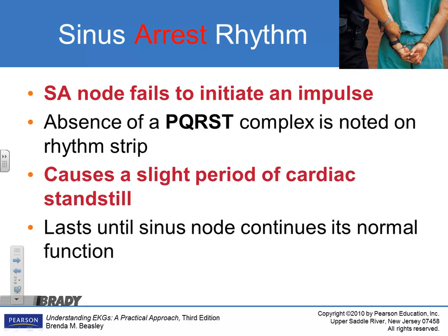Okay. Sinus arrest. With the sinus arrest, the SA node doesn't do what it's supposed to do. It's just like it's on break when it's supposed to pulse. So you'll just see there's just this void in the middle of your strip.